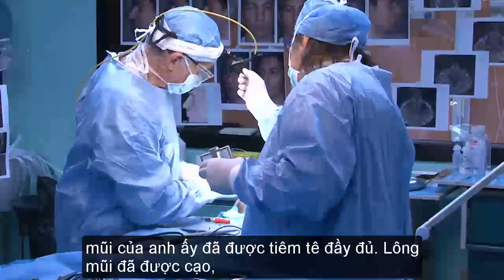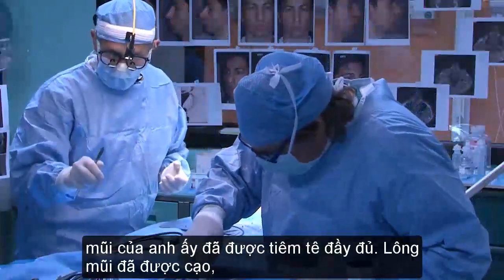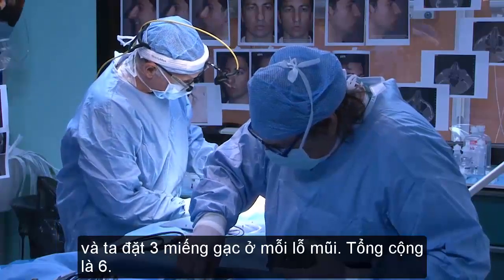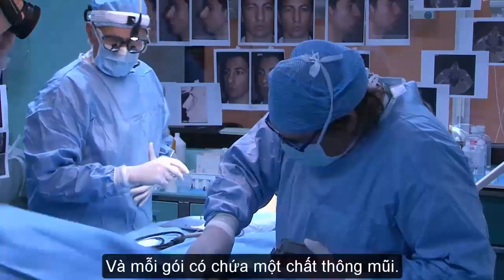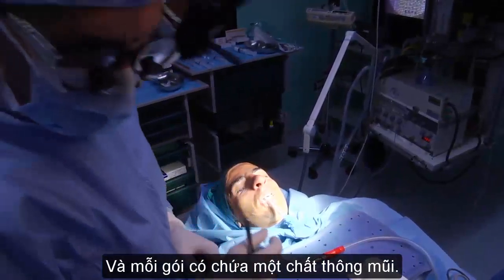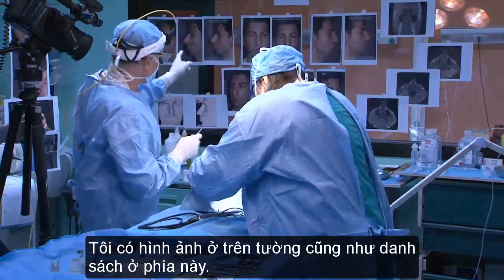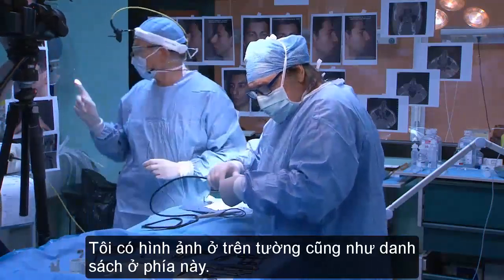So this nose has been infiltrated, his vibrissae have been shaven, and we put 3 gauze packs in each nostril, so it's 6. And each pack has phenylephrine, which is a nasal decongestant. It's like Otrivin, essentially, since of course you cannot use cocaine or anything like this. I have his pictures on the wall, and I have my list on this side.